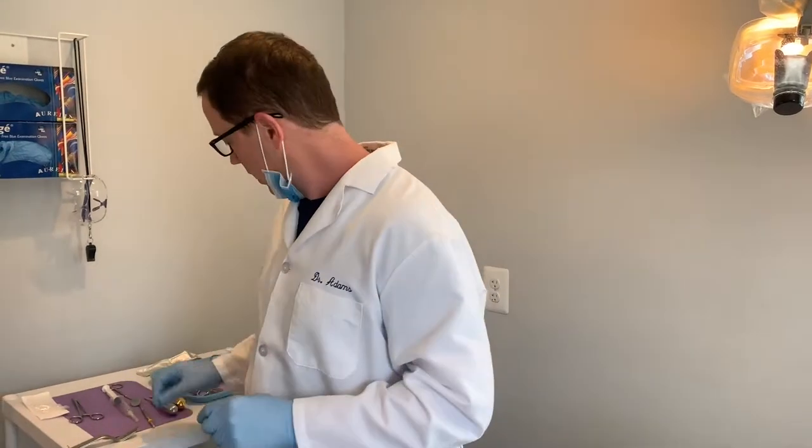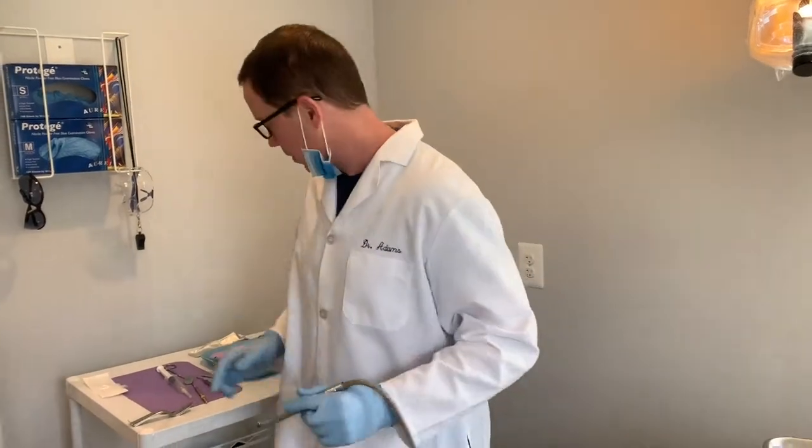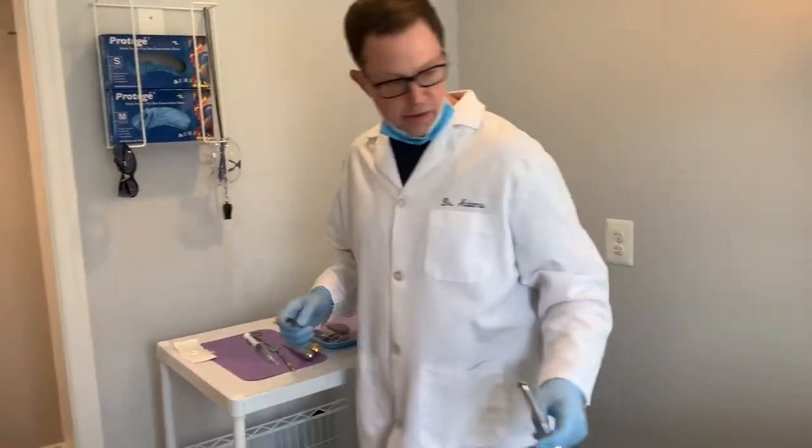And finally, we will take a stitch that dissolves on its own, and we will tie that around the extraction site. The gum tissue used to be attached to the tooth, so it's a little bit loose. And of course, we want to hold the platelet treatment down into the site. The platelet treatment almost looks like a yellow jello, and we'll wrap it around the extraction site a few times to keep the gum tissue nice and approximated up against the jaw, and also hold the platelet-rich fibrin in place. So we're going to go ahead without delay, and we're going to start removing this tooth.